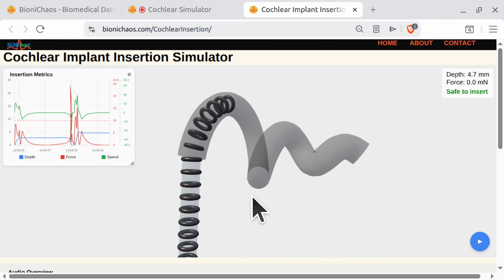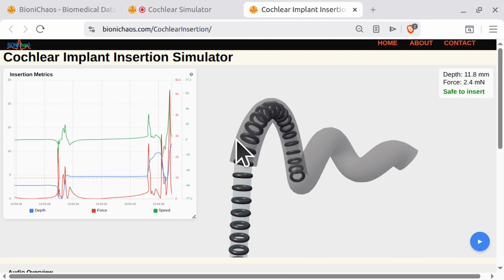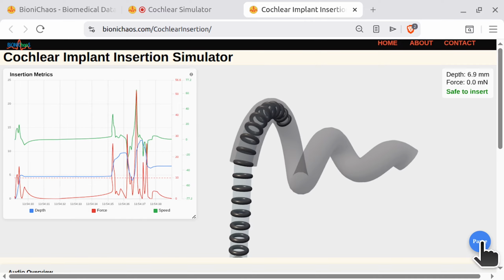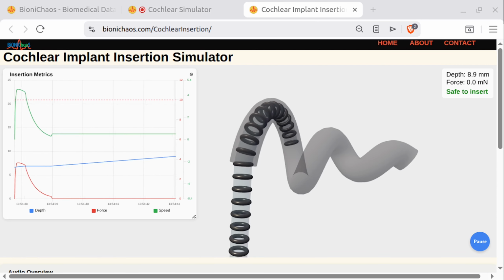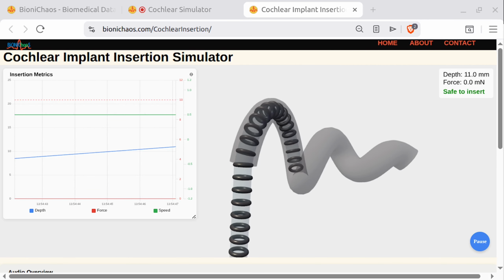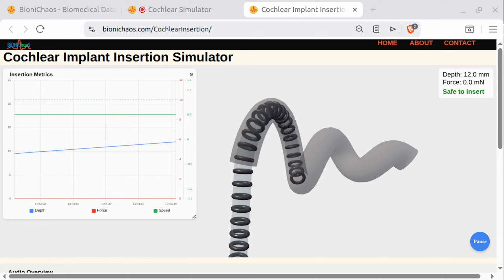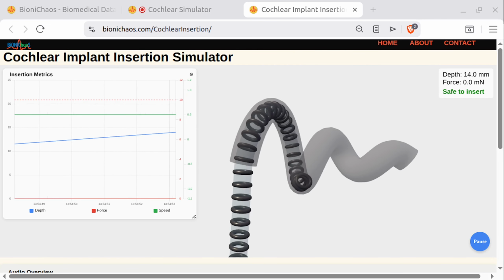Okay, then let's break down that trade-off by looking precisely at what happens during the surgery. Because to place the electrode array into the cochlea, a surgeon has to navigate a microscopic, incredibly delicate neighborhood of anatomy in the middle ear. Right. And the most vulnerable resident of that neighborhood is the chorda tympani nerve, the CTN. Yes, the CTN. This is where the patient's lived experience immediately diverges from the clinical success story.